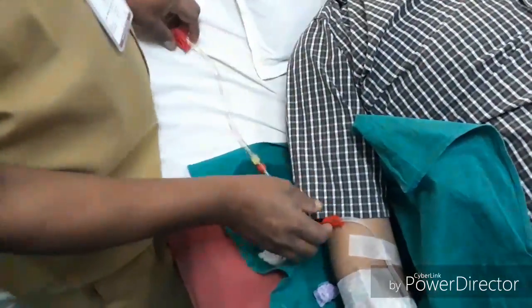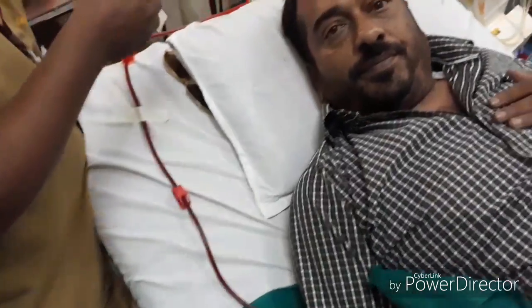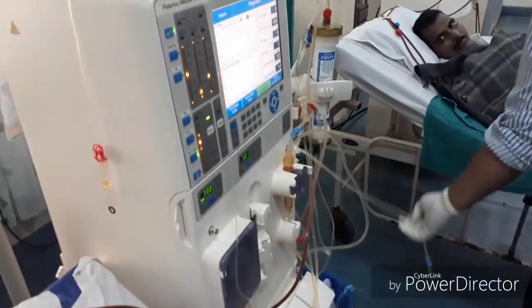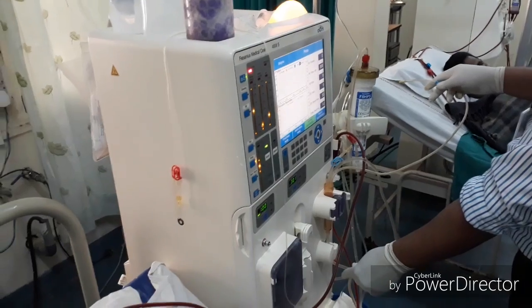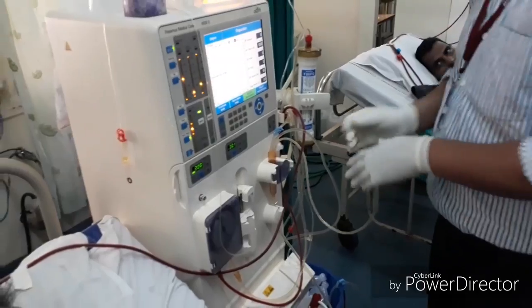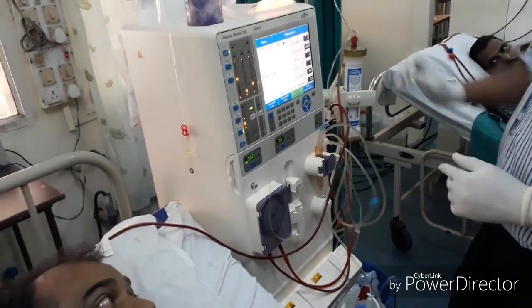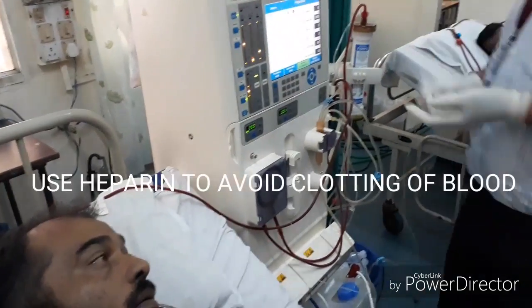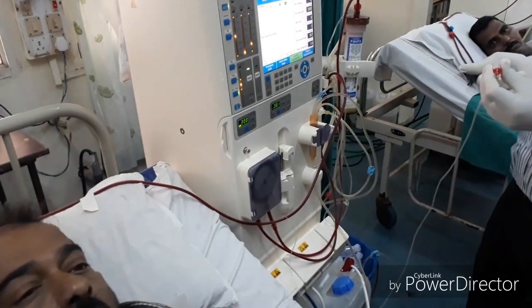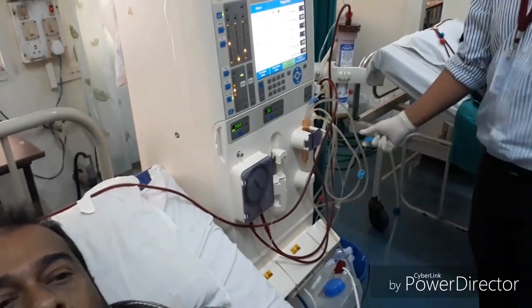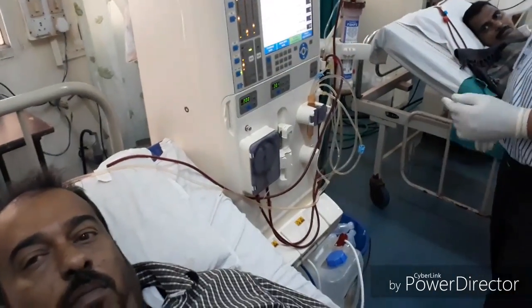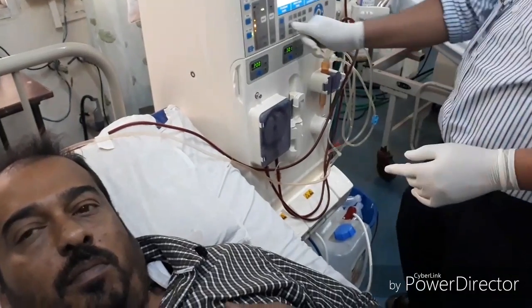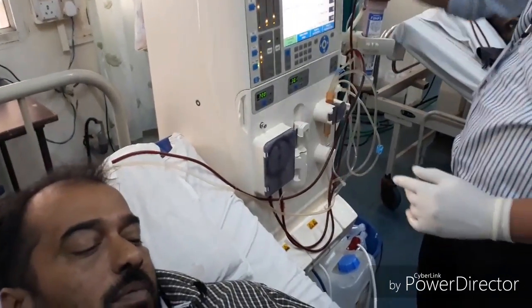We are connecting the arterial line. You can see the arterial blood coming and going to the dialyzer. The flow of blood is at 250 to 400 ml per minute. The prime requirement before doing dialysis is heparin — because there are chances the blood may clot in the extracorporeal circuit. Therefore we use heparin, with a usual dose of 2000 to 5000 international units.